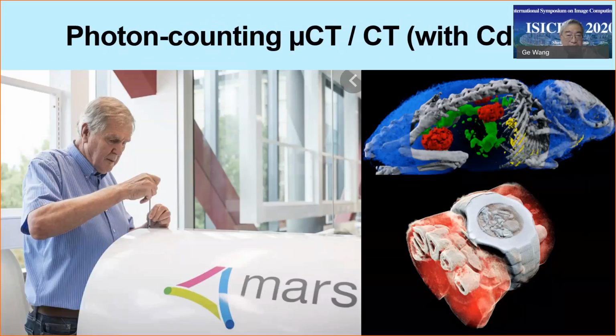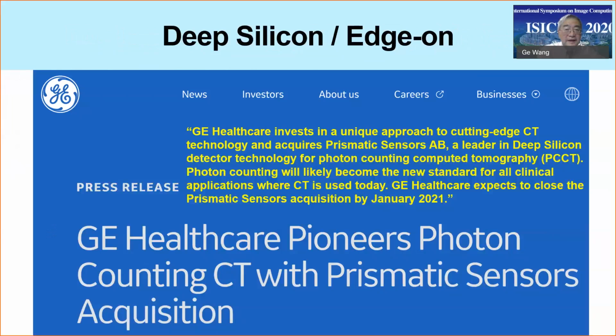In the next stage, we are collaborating with MARS in New Zealand, using real photon counting detector data, to try to do quantitative photon counting reconstruction. In parallel to this line of research with the cadmium telluride detector, we also work on deep silicon edge-on technology. Coincidentally, GE announced that they acquired a photon counting company, Prismatic, and they also use deep silicon edge-on technology.